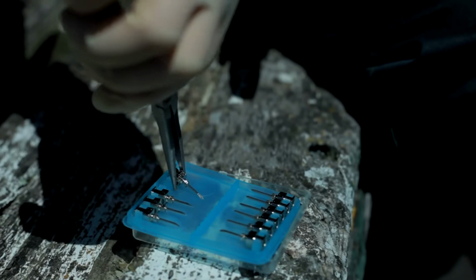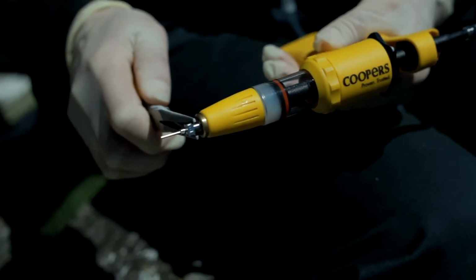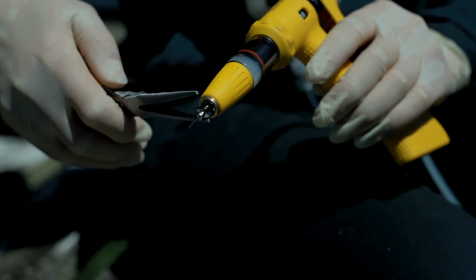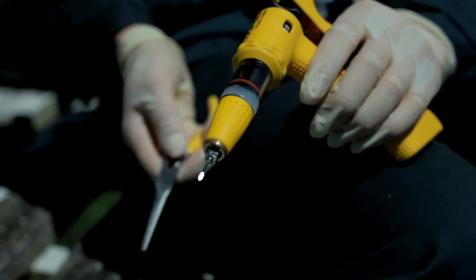Also check your needle. If you are using a needle that is too small in gauge, it will cause difficulties, or it could simply be blocked. Watch that your needle has not travelled straight through the skin tent and out the other side. If this has happened, you will be vaccinating into air.